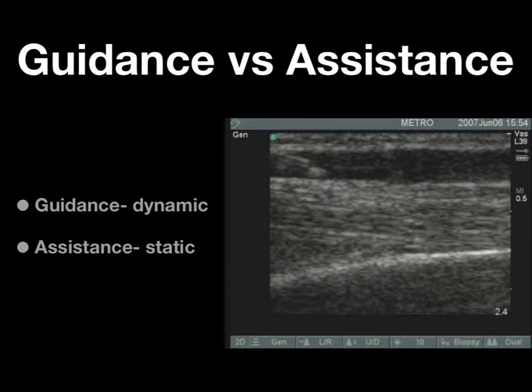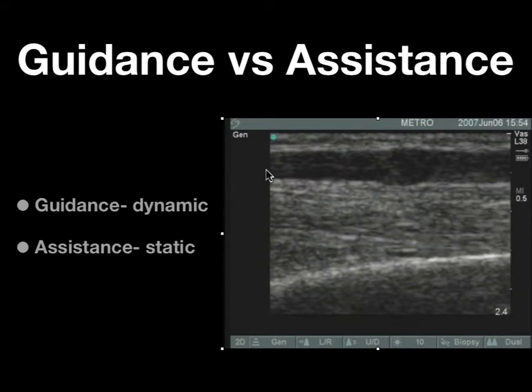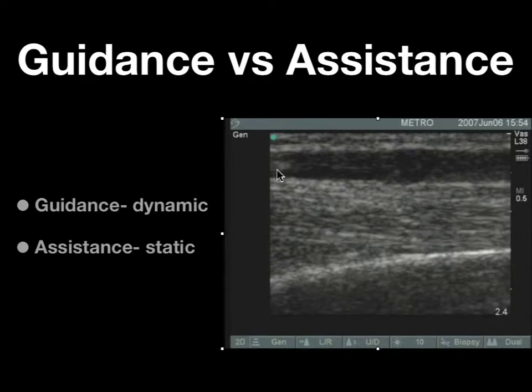During this lecture, you're going to hear me use the terms ultrasound guidance and ultrasound assistance. Ultrasound guidance means that under real-time direct visualization, you're going to watch the needle enter the vessel. Ultrasound assistance means you've used ultrasound to help you mark the location of the vessel and its course, but the procedure is done without ultrasound.